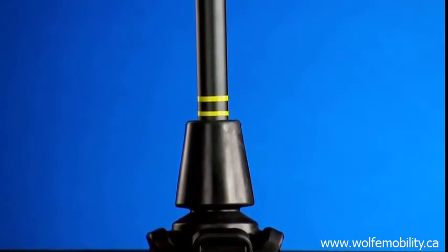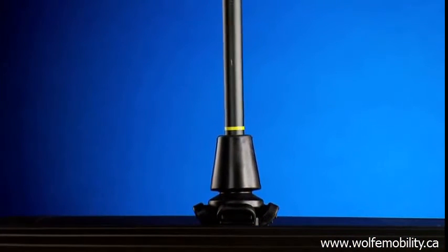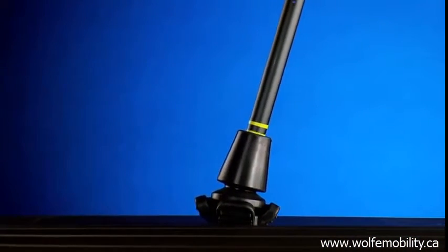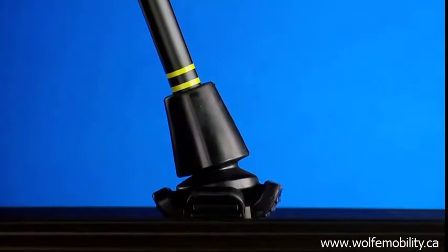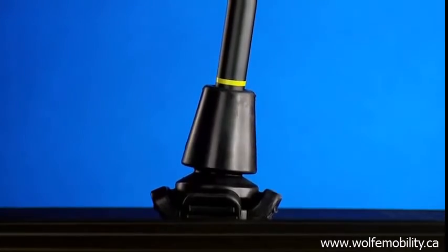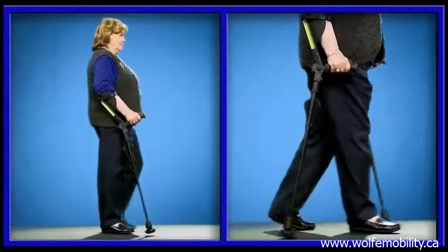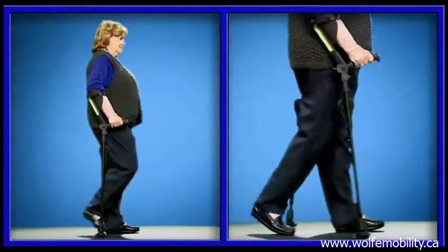This special spring-loaded mechanism is soft enough to receive and soften the landing of the crutch on the ground, and hard enough to avoid a sinking feeling. Likewise, it facilitates and contributes to the crutch being raised off the ground while being pulled by the user, thus contributing to a much smoother, stable, and comfortable walking.